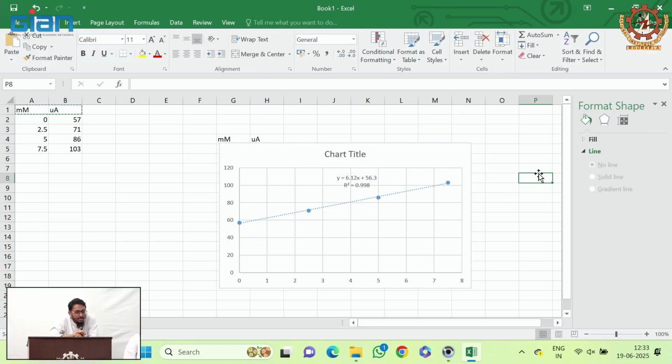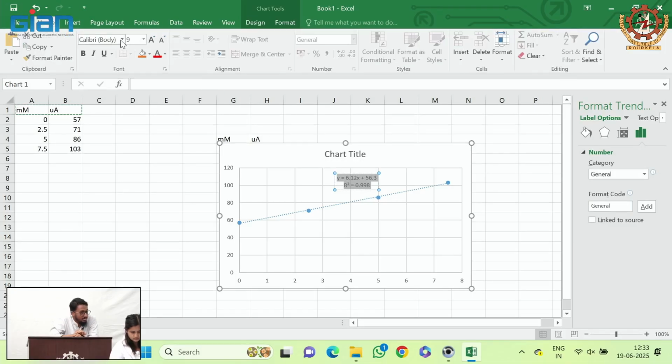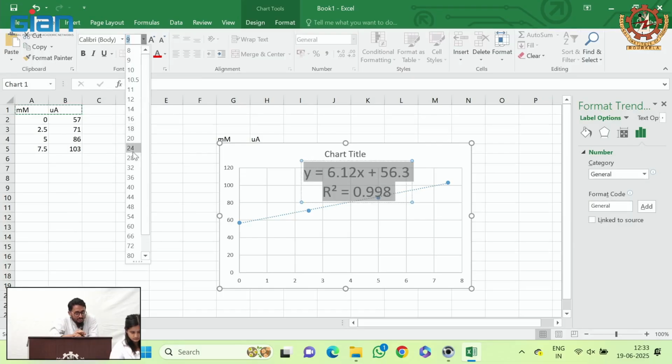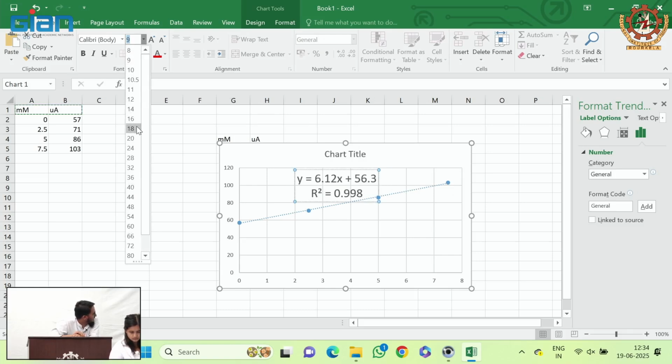Can you make the font larger, please? That equation, the straight line. So that is the slope of the straight line. The slope of the straight line gives us the sensitivity of the sensor. Make it larger, please. So the sensor is linear in the concentrations that we have tested.